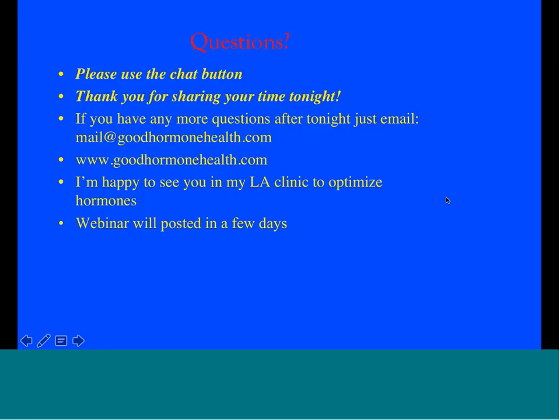Katarina asked, so it's like a blood sugar monitor used for diabetics? Exactly. You check your sugars, and this will be similar. You're checking your cortisol, and you use that to guide you on whether you should do further testing or take more hydrocortisone, again, once this gets more approved. And I think also the difference, from what I understand, is that it's on your computer or on your phone, and you can send me or somebody else the readings, and we can adjust. On many glucometers that's done, but not all of them.